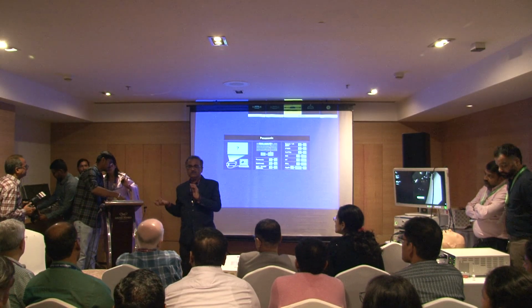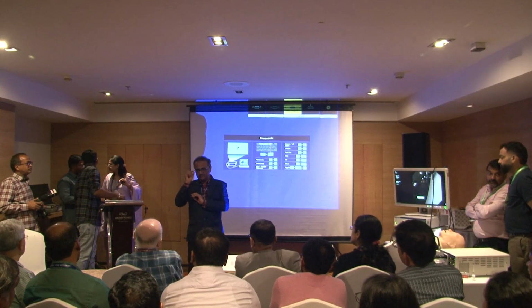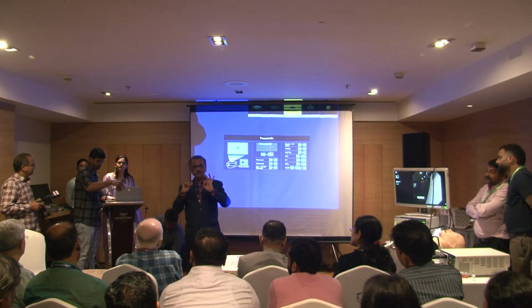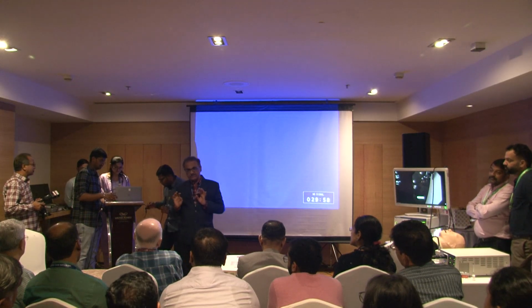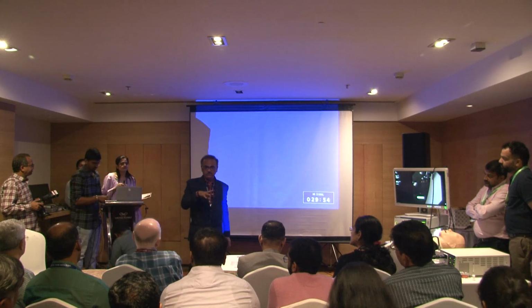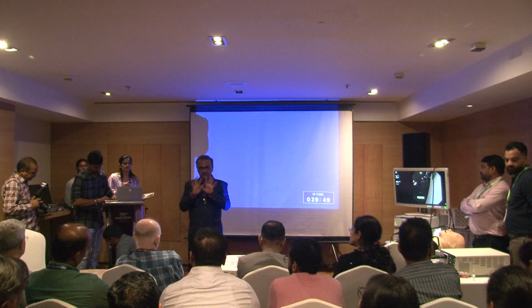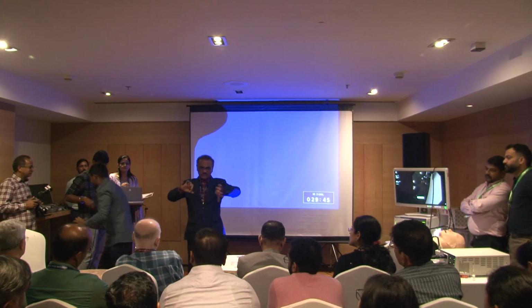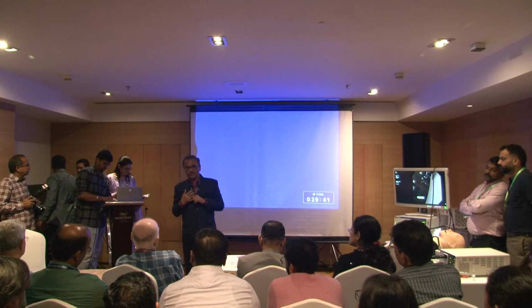Have a 1 in 10,000 adrenaline saline swab, hold it with your forceps with the scope, under vision, decongest those granulations, then do suction, give some time, and again decongest those granulations. Once you see that the granulations are becoming less, decongested, and the foreign body is safe, then try to remove the foreign body.